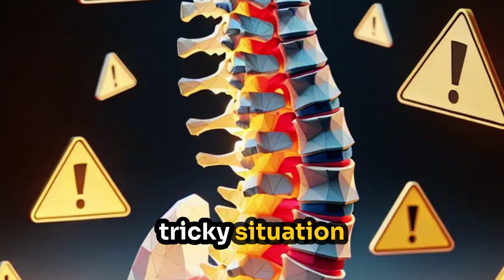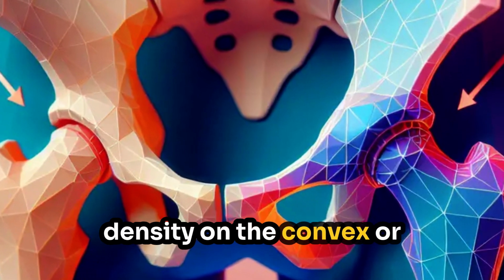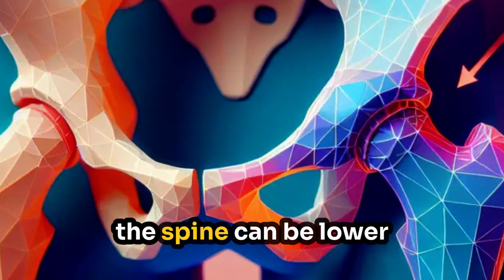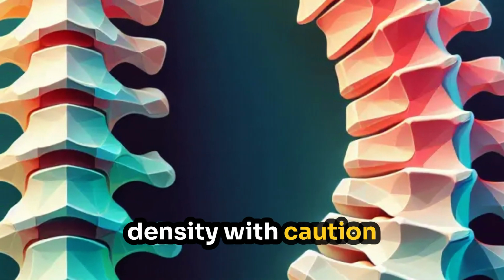And here's another tricky situation. If the patient has scoliosis, the bone density on the convex or outward curved side of the spine can be lower. Always interpret scoliosis-affected bone density with caution.